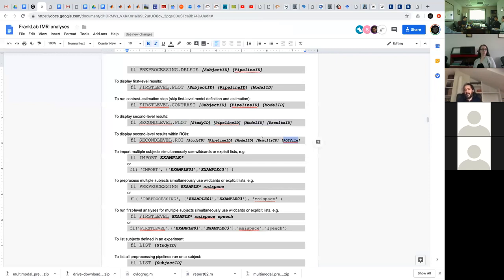Right. I mean, that happens typically. That happens even in MNI space, right? You can define an ROI in MNI space, but then when it matches each individual subject anatomy, it's going to match at a slightly different location, because the transformation between the common MNI space and the original raw subject-specific space is different for every individual subject. But that's not the type of subject-specific ROIs that I'm talking about. For all of those cases, there is still a single ROI file, because that is defined at the level of your second level analysis, which is basically either FS average space or MNI space.